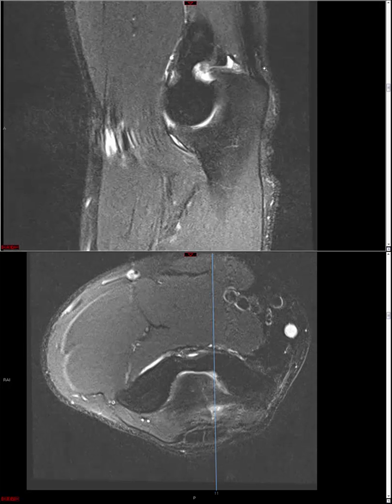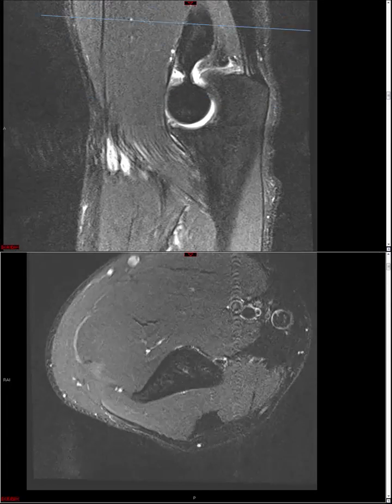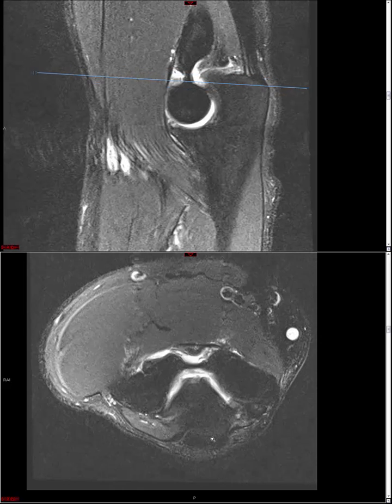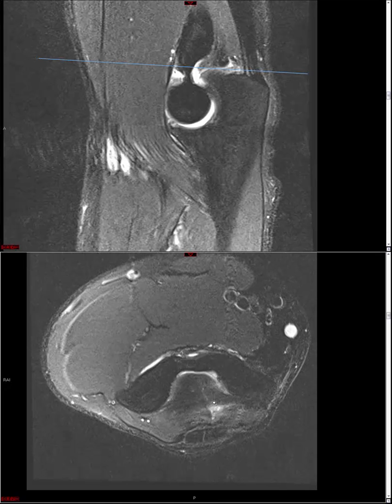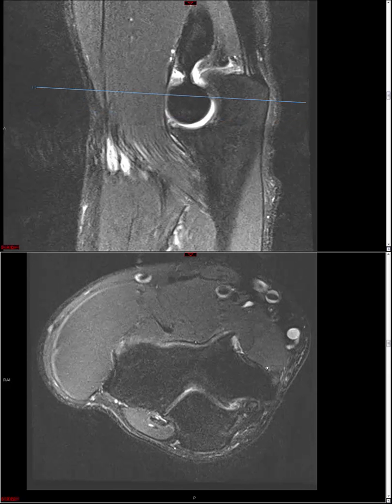Note too that the triceps has superficial and deep fibers, arising from the three heads of the triceps tendon. So make sure when you see a tear that you ask yourself, is this a full thickness tear or is this a partial thickness tear? Here's the anconeus muscle. It's an easy way to tell you which side of the elbow is lateral. Also notice the more protuberant medial epicondyle, and then sometimes you have other easier clues, like here is the ulnar nerve in the cubital tunnel, for example.